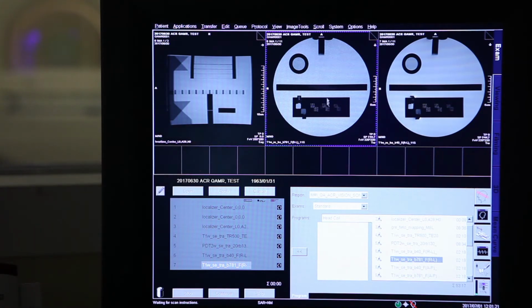This is the magic thing when you're using sequences with higher bandwidths. The drawback is the SNR. You see the graining in the image of this phantom. On this specific slide, there's more noise. But you have linearity, susceptibility is diminishing, and you have depiction of the anatomy as it is, because you have fat and water at the position that they should be. At the expense of SNR all the time.